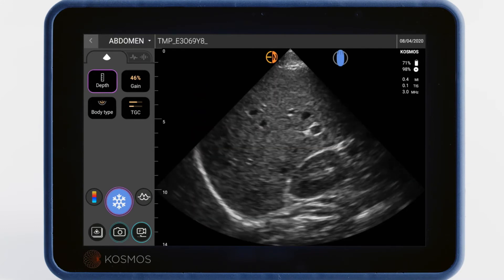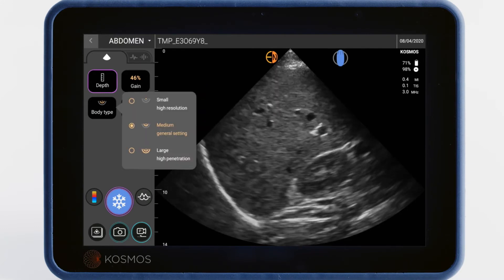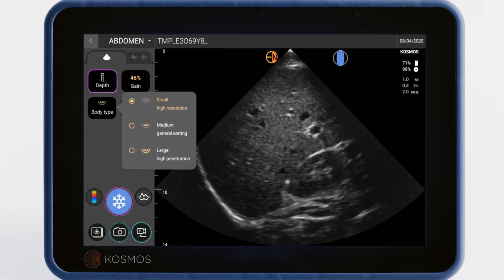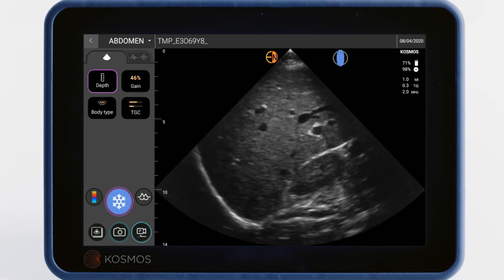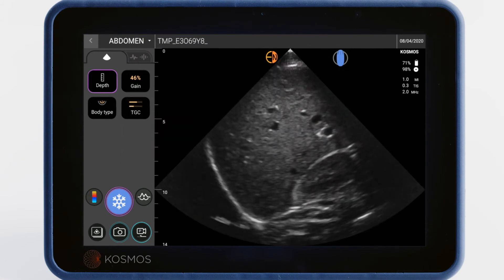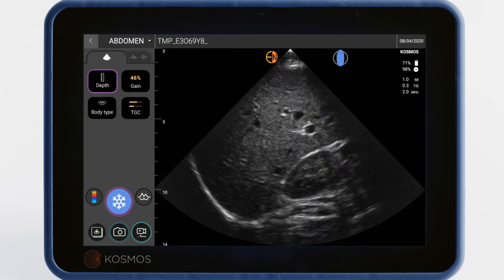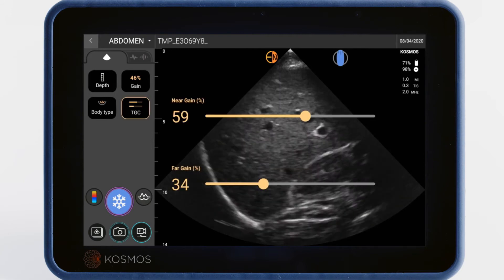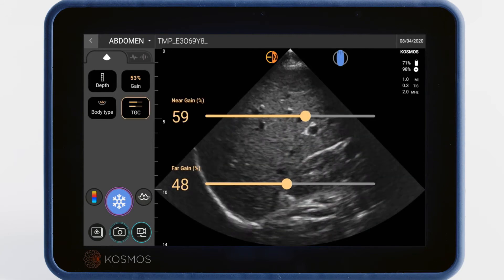You can also adjust the ultrasound based on body type, which adjusts settings based on the patient's BMI. And finally, you can adjust the TGC by selecting this icon to adjust gain at various depths of the image.